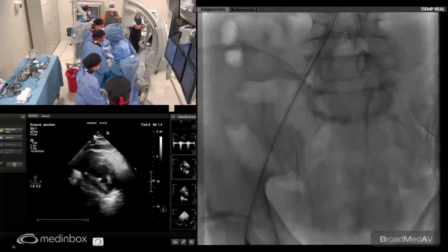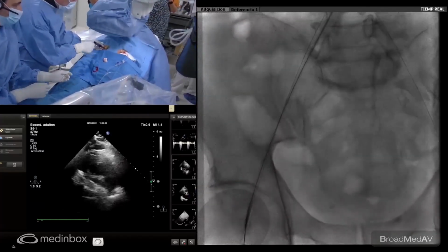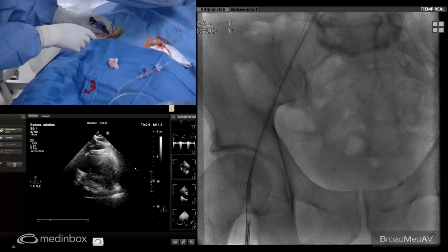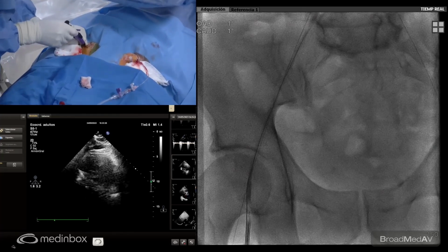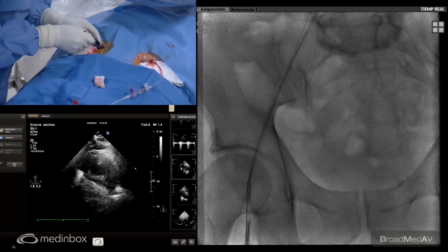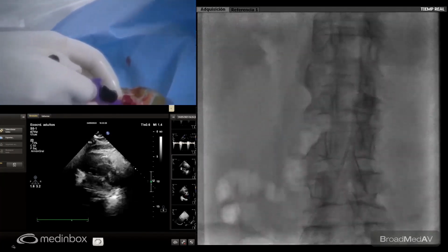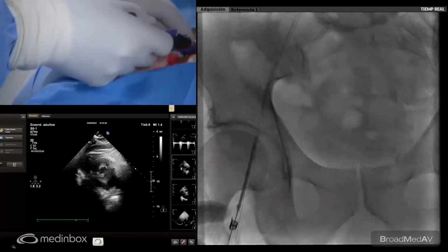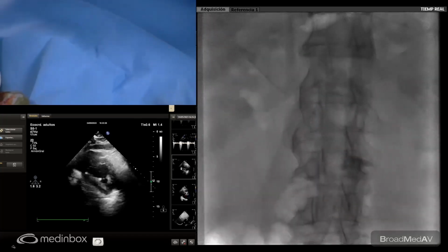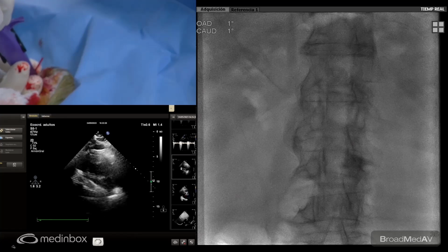So here, when we have a very long distance, it's important that you don't have a kinking before entering the artery. So move down, okay. You see, before having back flow, you see that I'm almost completely in. Show me again. So here I'm sure I am in. Go back. So I will open and retrieve it, rotate, and let's go with the first.